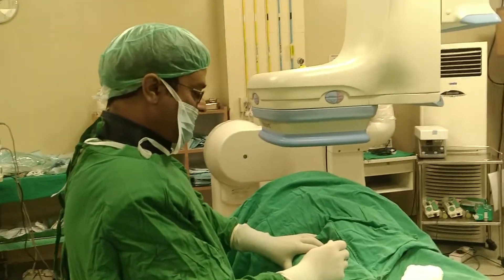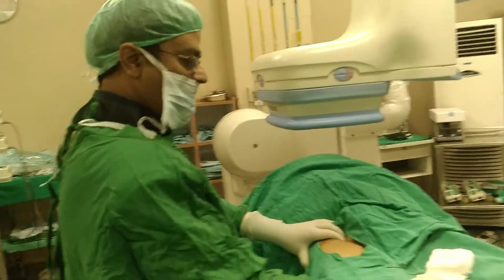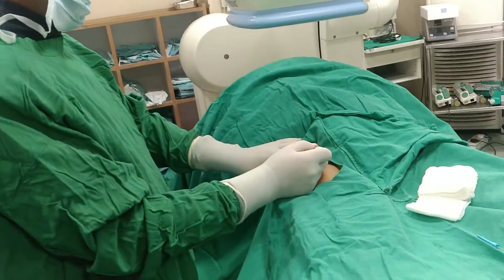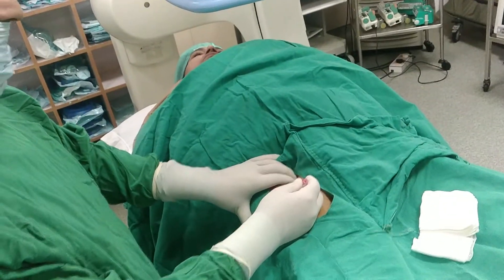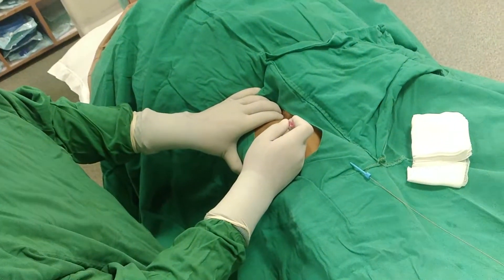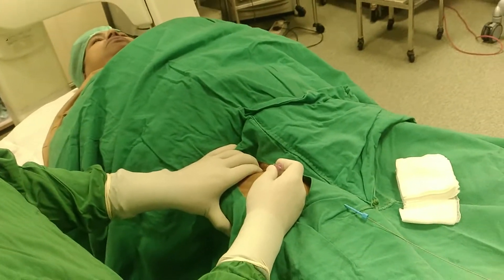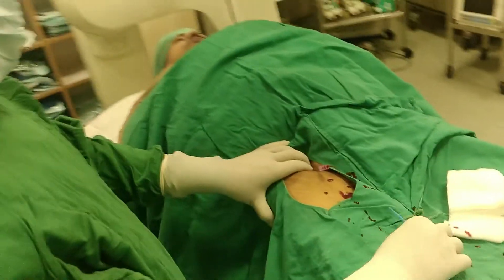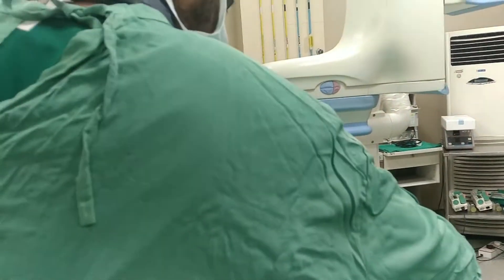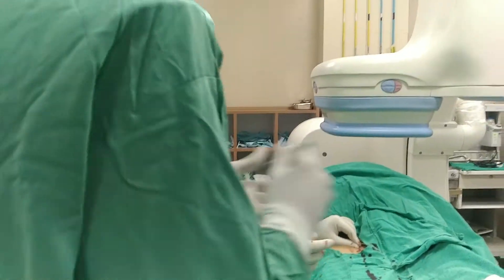We have this femoral puncture. We've given local anesthesia here, palpated the artery, and given local anesthesia with a puncture needle. Using a guide wire compatible with a 0.035, we palpate it against the bone, go ahead and punch the artery, get blood flow, then put in the guide wire. Dealing with the marks, we take the sheath.